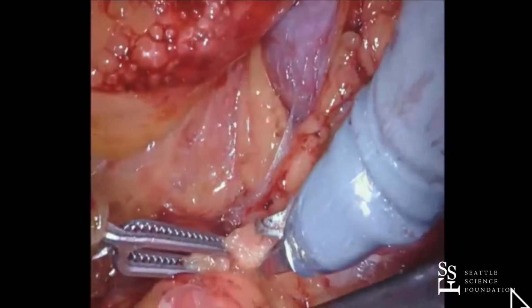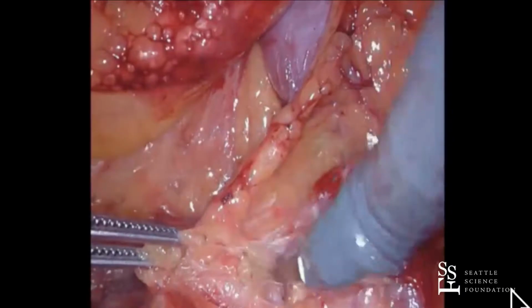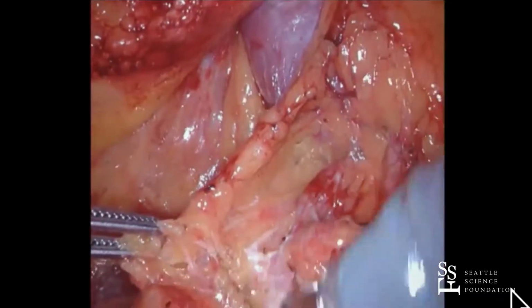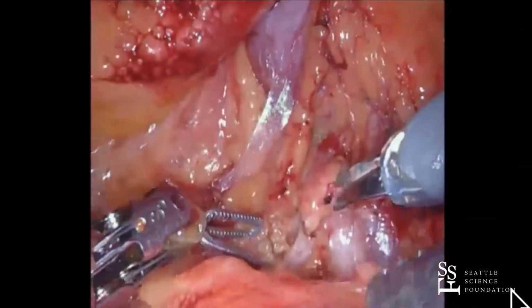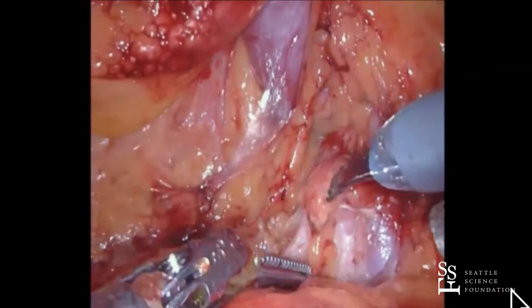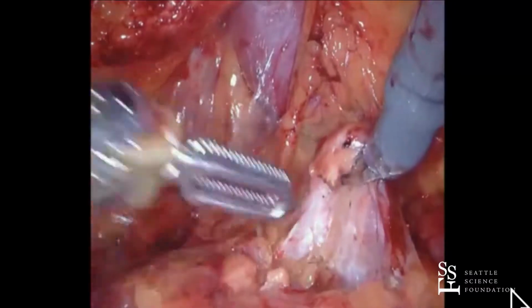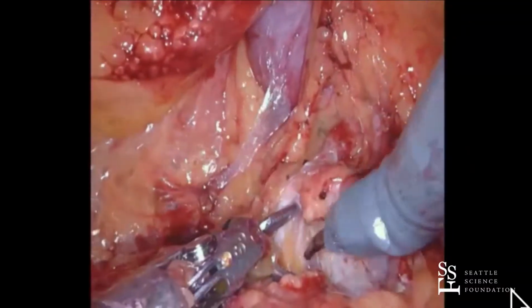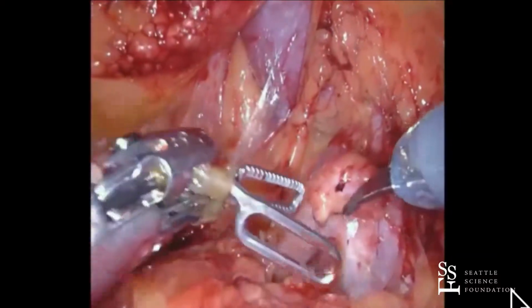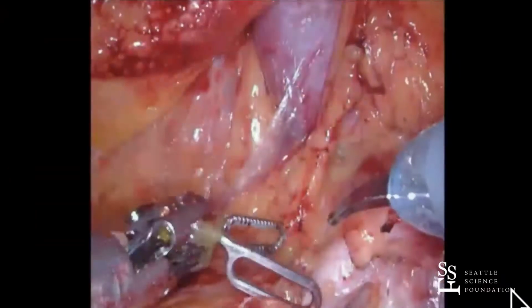That's not a problem retroperitoneally, although transperitoneally, it is a problem because, I mean, you can work and get behind the cava, but right here, it's in your face. I mean, you don't have to worry. You're behind the cava, kind of by definition. Yeah, I think if you're doing a retroperitoneal, the hardest thing probably would be the venous dissection and clamping the vein. Now, again, I think nowadays people don't really clamp the vein, so it's not a problem. But if you're used to clamping the vein, you're going to have a harder time doing it retroperitoneal.